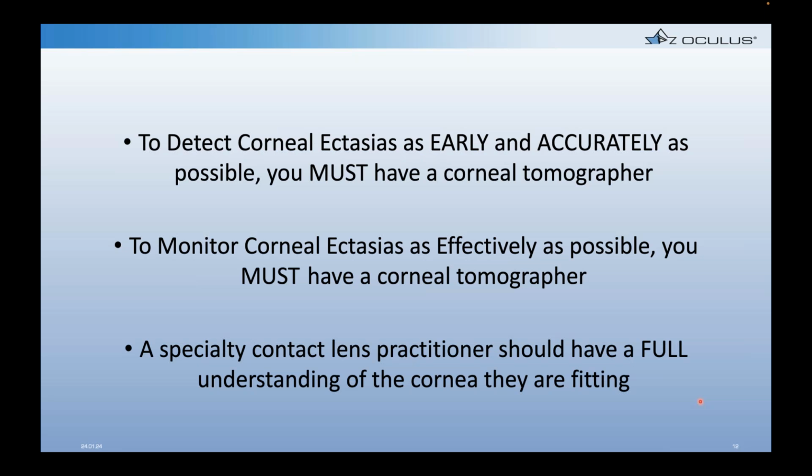And again, a specialty contact lens practitioner should have a full understanding of the cornea they are fitting. We don't want to just be a contact lens fitter who is not able to look at that cornea and detect whether our lenses are having an adverse effect on those corneas. We want to be able to be an astute clinician, even as this patient may see other doctors. We certainly want to be able to care for them the best we can as well.